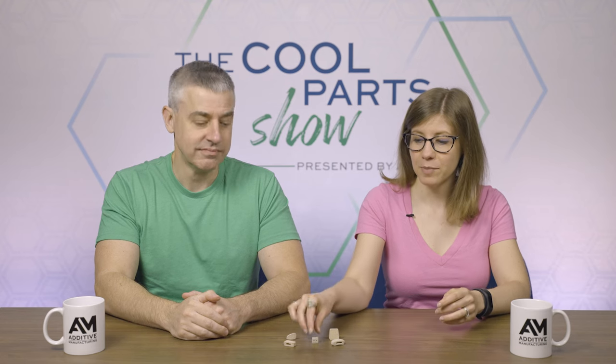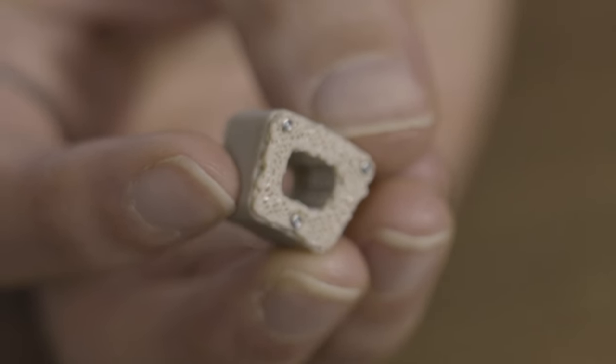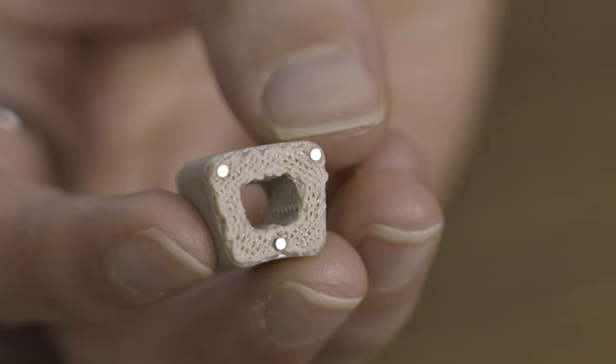Today, we're going to be talking about this 3D printed cervical spine implant. This is an FDA approved device, and it's made from PEEK, polyether ether ketone. So in other words, it's a polymer.